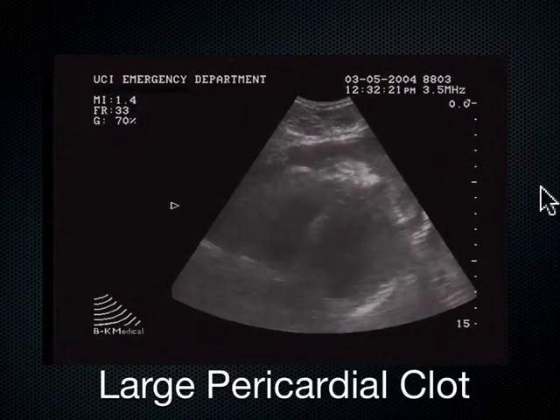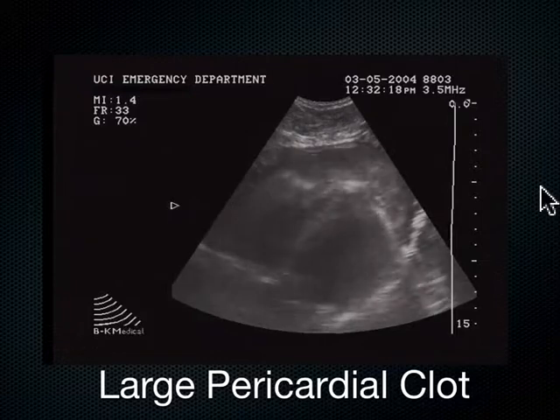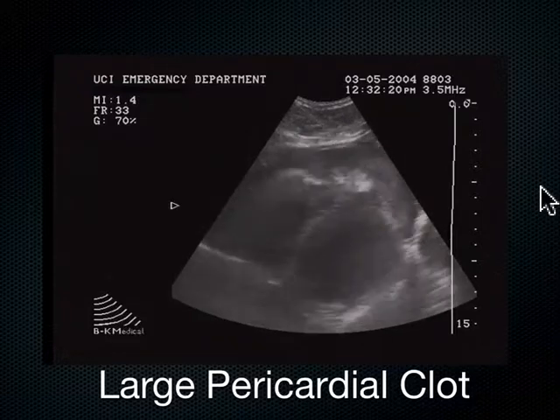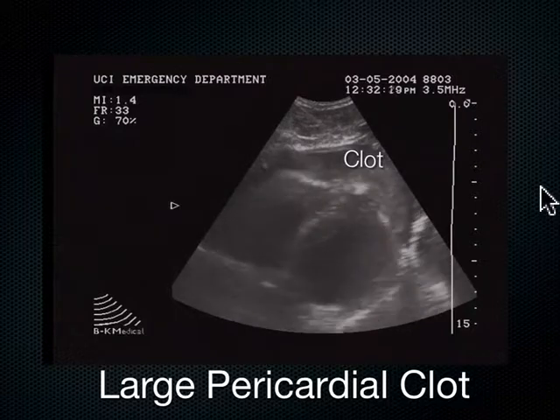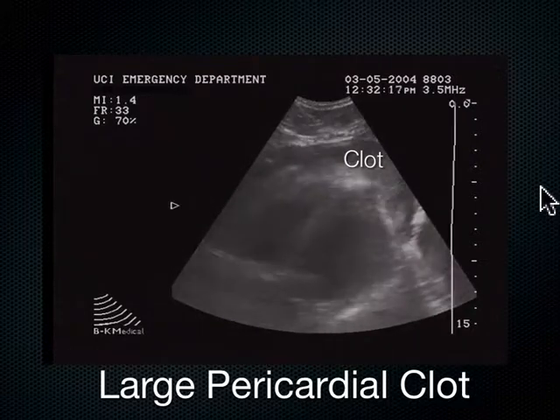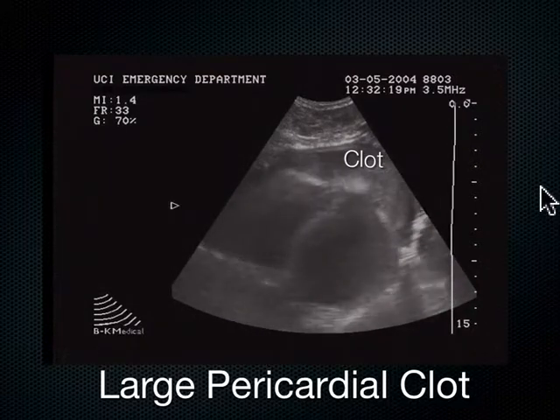This is clot. Hard to differentiate the two. And you're going to run across this more than really anything else. But is fat going to ever collapse the ventricle like that? Fat should not cause the ventricle to collapse, no.